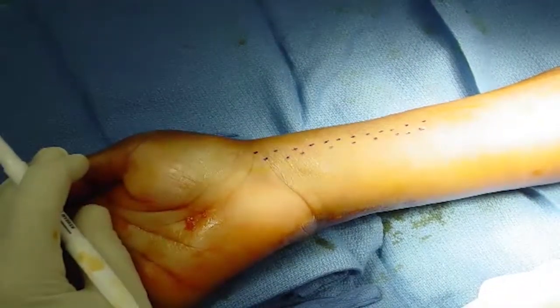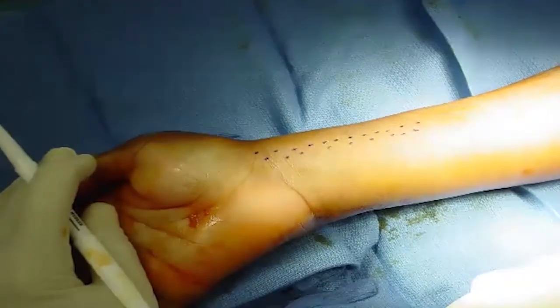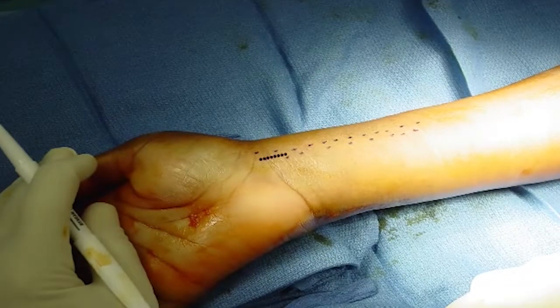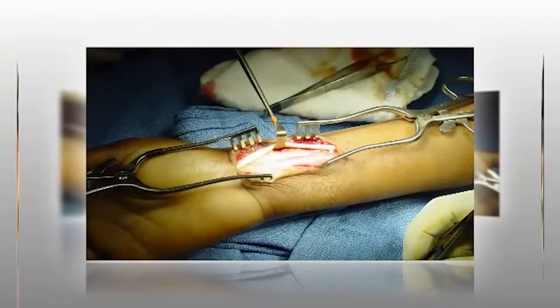To maximize exposure, a towel is placed under the wrist, placing it in extension. A longitudinal incision is made approximately 6 centimeters in length, just radial to the FCR tendon, to protect against injury to the palmar cutaneous branch of the median nerve. The tendon sheath is opened and the tendon is retracted radially to protect the radial artery.